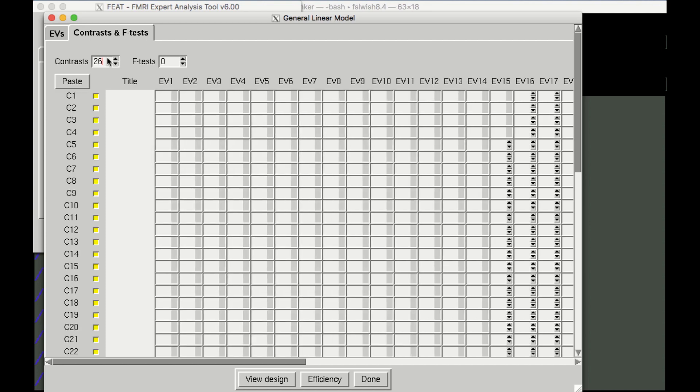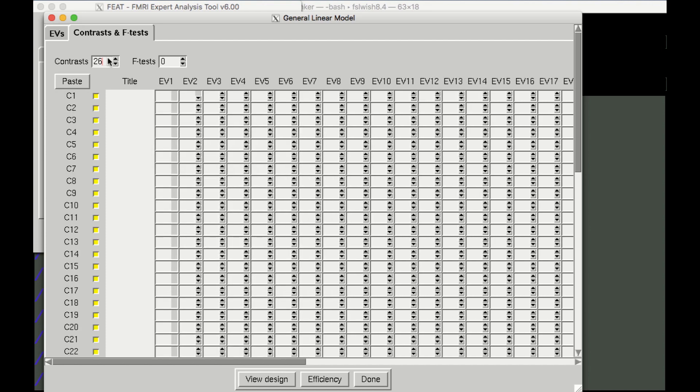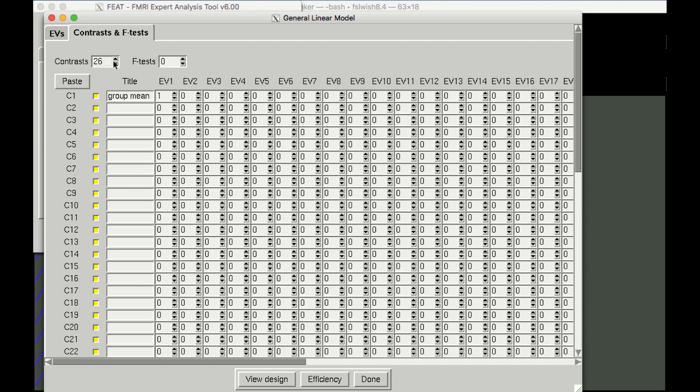Change all of the numbers on the diagonal to 1. This tells FSL to calculate an average estimate for each contrast that was specified in the Data tab.